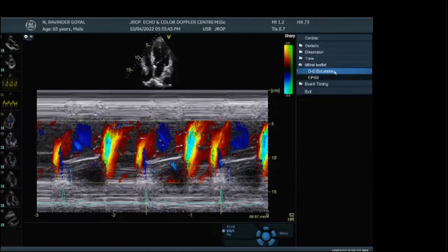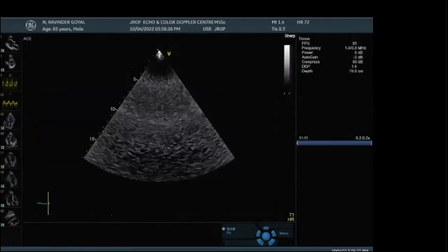Okay. Dr. Dinesh Tiwari, we will learn the dimensions and EF calculation later on, two weeks down the line. Today we are trying to expose you to color Doppler, pulse wave, and continuous wave Doppler. Then we are left with the views, for live demonstrations. When we talk about the views, we'll do the measurements also.